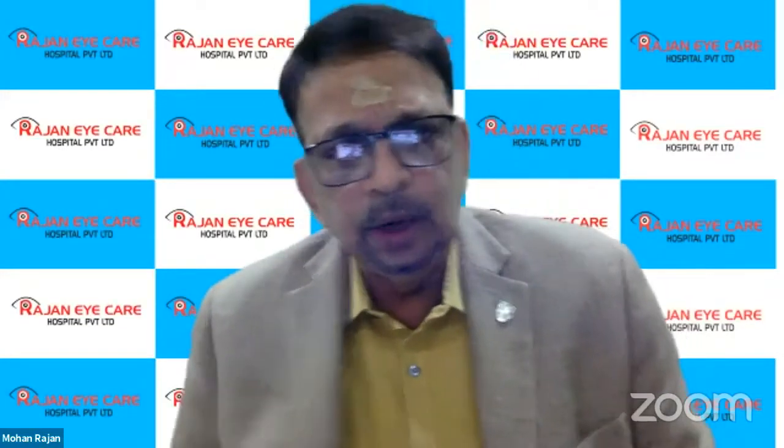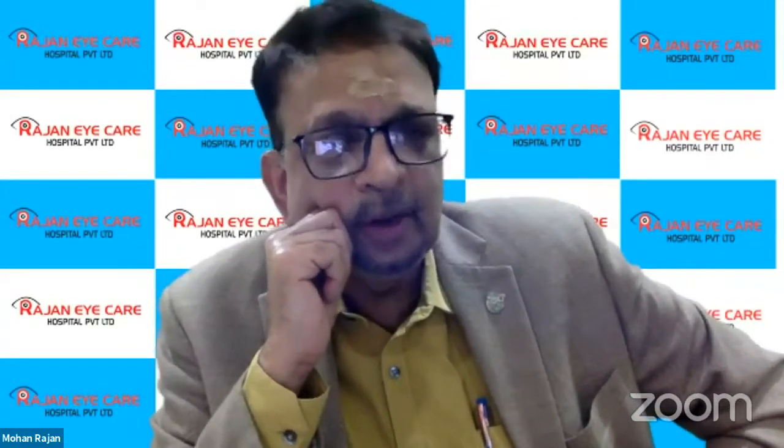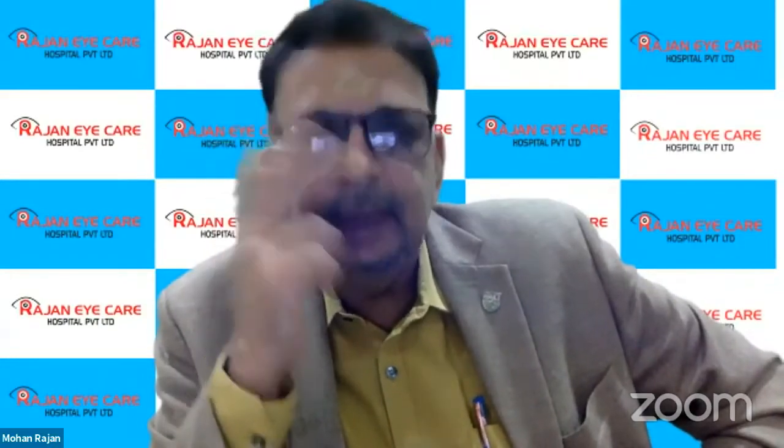Okay. Any experience with LRIs whenever you have a residual astigmatism? Yeah, I'm doing LRIs. I'm using the femto catalyst for the LRI. The femto LRIs are much more reliable for me. I'm using that especially for about 1 to 1.5 cylinder now. So it works very well.